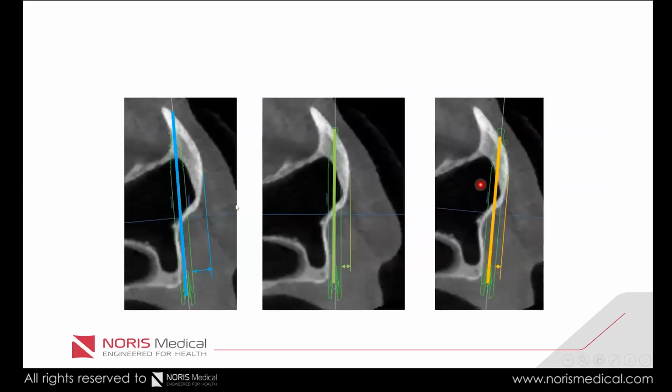And that's how it looks actually in real life. If we didn't go to the right position, we are actually pointing to the temporal fossa, and this is the correct, what we've done, what we wanted to do. And if we went not the correct way, we have much less bone here than we have here. Okay, so this is what we wanted to do, and we have a tool to do that.